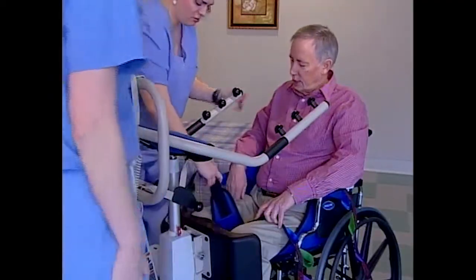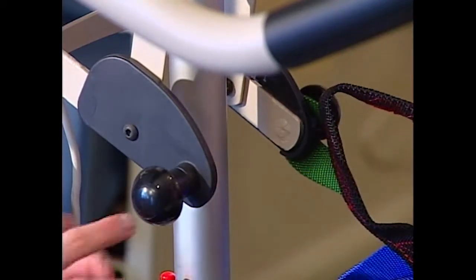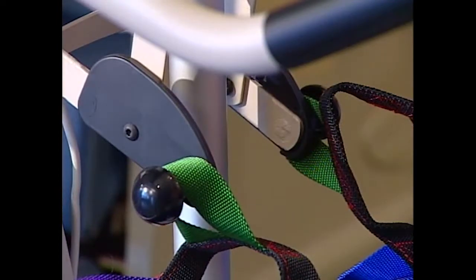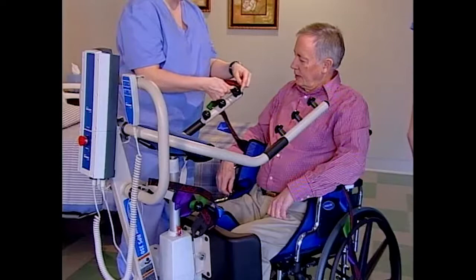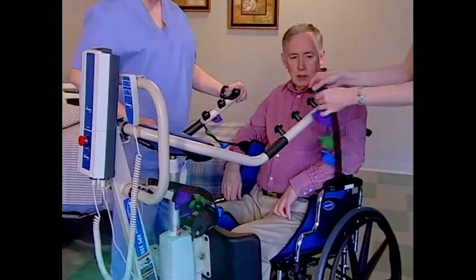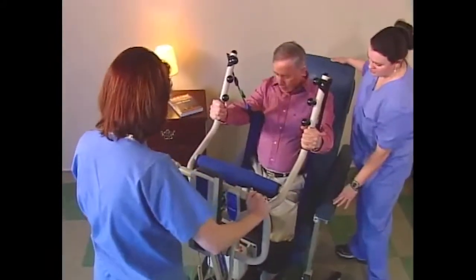Pull the thigh supports forward and attach them to the forward most attachment points, which are located above the knee pad. Make sure you attach each strap to the lift using the same color loop. Attach the top straps to the lift arms, using the same color loop on both sides and choosing the loop that most comfortably attaches without too much slack. This will make sure the resident stays comfortable and stable during the lifting process.